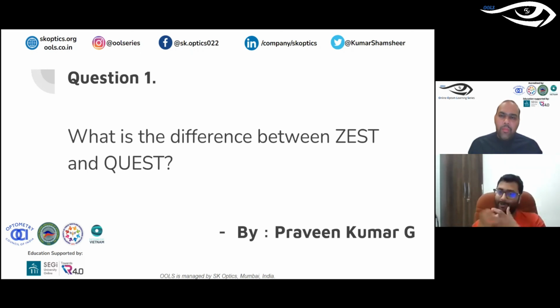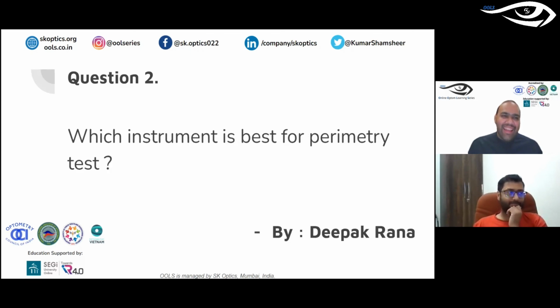You can answer it on your own. You collect your own normal visual fields data and normal Western field data, and then you build your own probabilities. You ask Western counterparts to build their own probability maps and then test them on your glaucoma population and see how these probability maps differ between Western and Indian populations. So that's a study. You guys can do it. Yeah, it opens up areas for research.